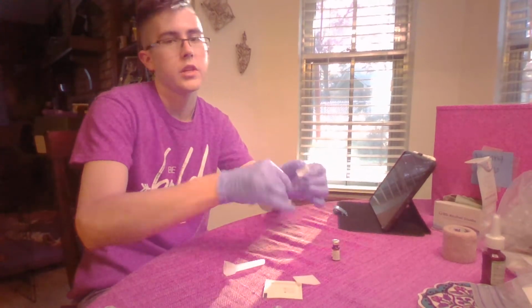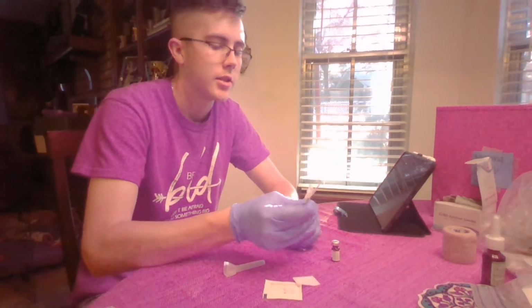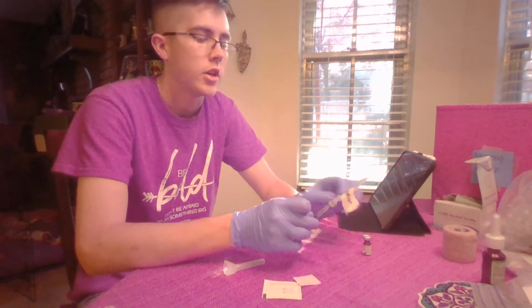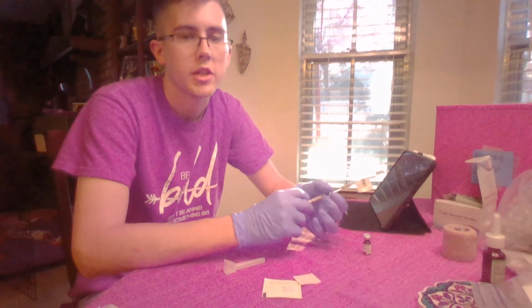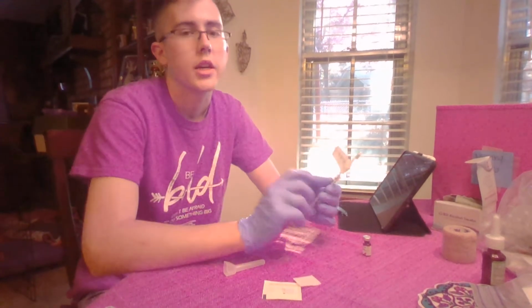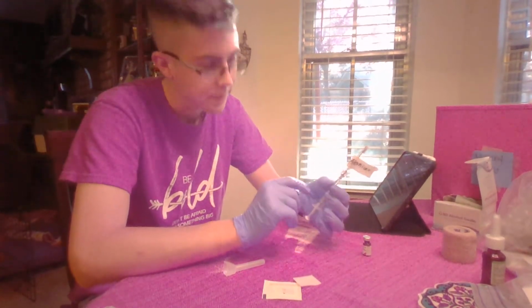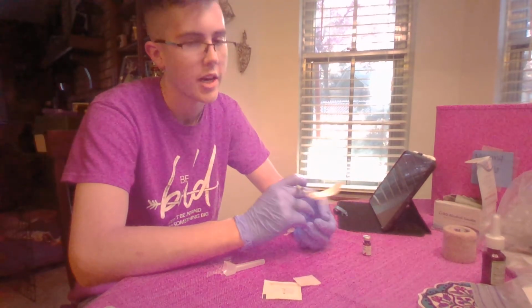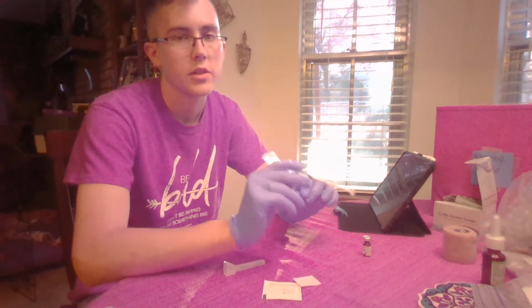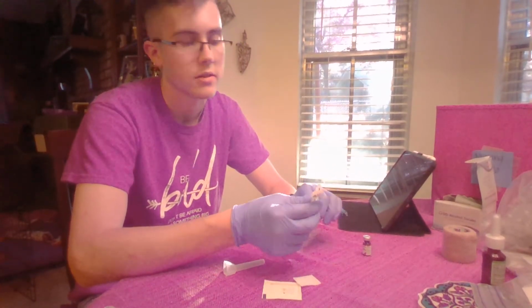Okay, remove this, place it in the sharps container, put on my atomizer, cease any form of ventilation, go over and inspect my nostrils to see which one is bigger, has the least amount of obstruction. Then I'll go in and insert the medication briskly, and then I will place all of this into the sharps container, resume ventilations, and then check for any undesired side effects.